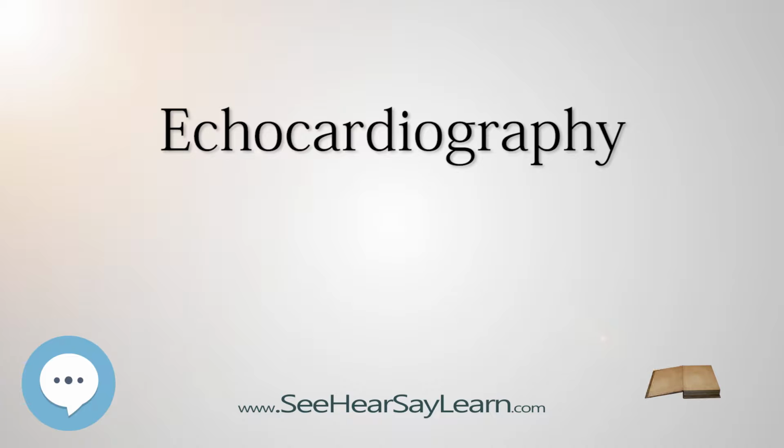The Doppler technique can also be used for tissue motion and velocity measurement, by tissue Doppler echocardiography. Echocardiography was also the first ultrasound subspecialty to use intravenous contrast. See contrast echocardiography. Echocardiography is performed by cardiac sonographers, cardiac physiologists, or physicians trained in echocardiography.